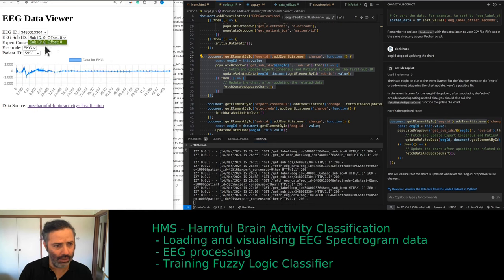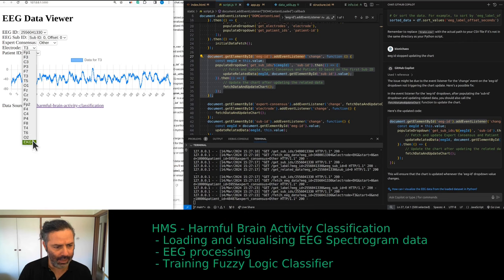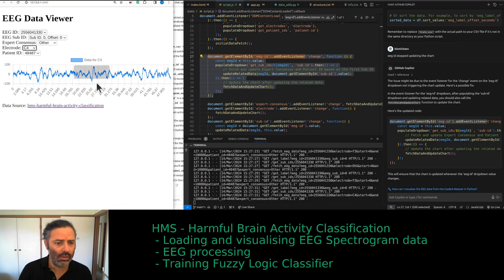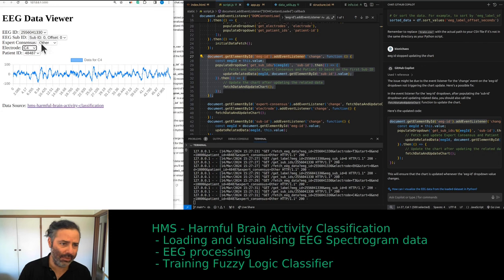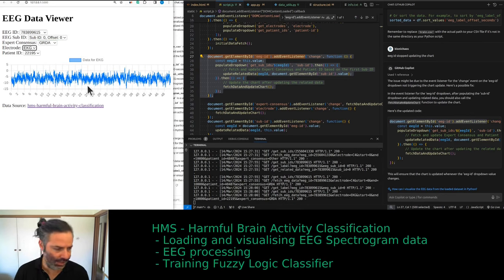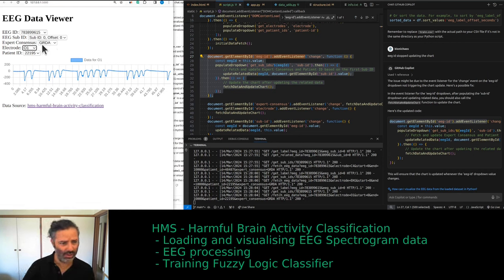The ECG is most of the time quite noisy — not a great ECG. You could expect that when the ECG looks like that, there might be something wrong with the data as well. It looks like baseline EEG but it was labeled as AVA. There's only one 50-second segment, and the ECG is actually missing. The EEG is not great, and this was labeled as a clinical — what's called a general — there's a lot of rubbish.